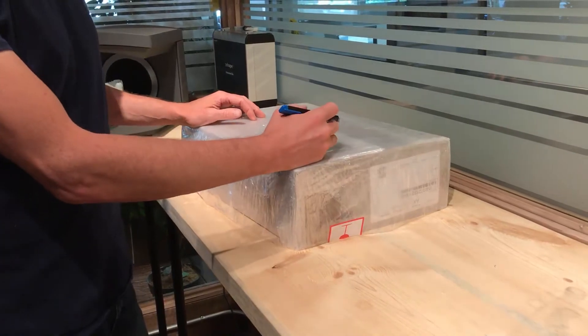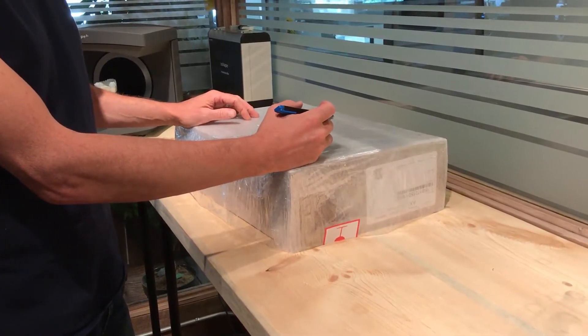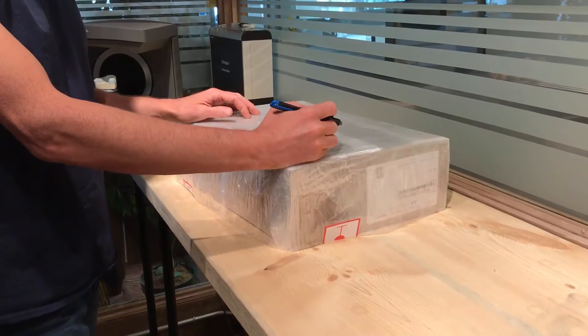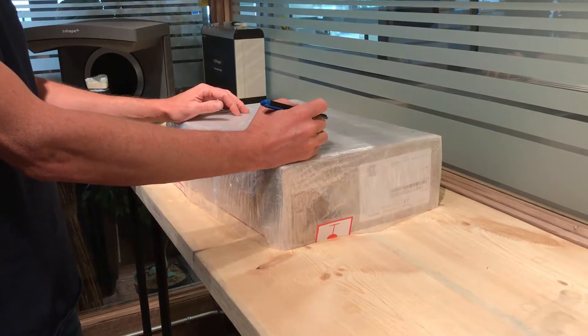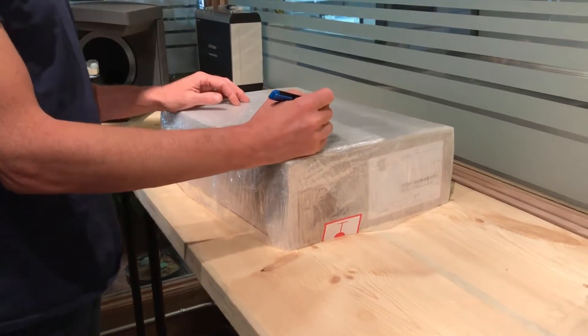Hi everybody, it's Michael and Tony from Argent Canada. We're part of the implementation team of the new Trios 3 wireless pod. We're going to be doing a quick unveiling — an unboxing of what we feel is probably the first Trios 3 wireless intraoral scanner in Canada. So we're just going to start that right now.